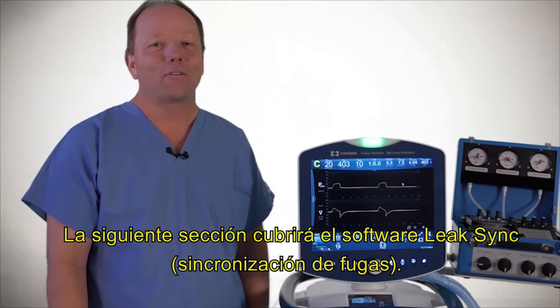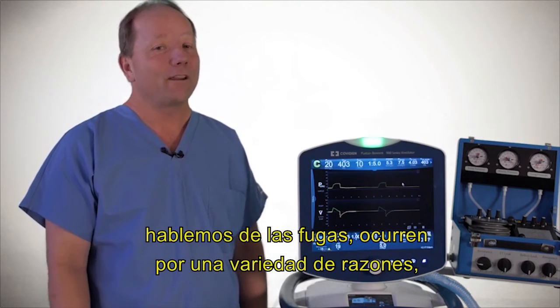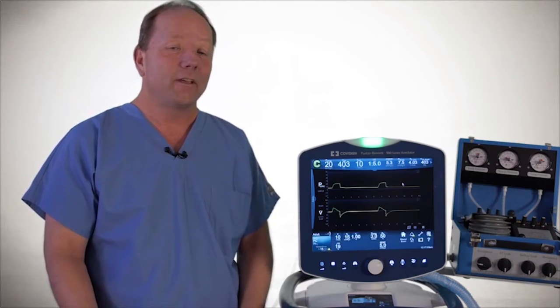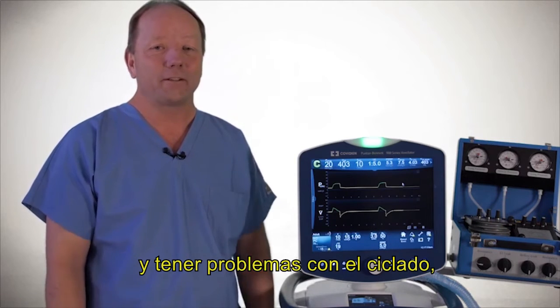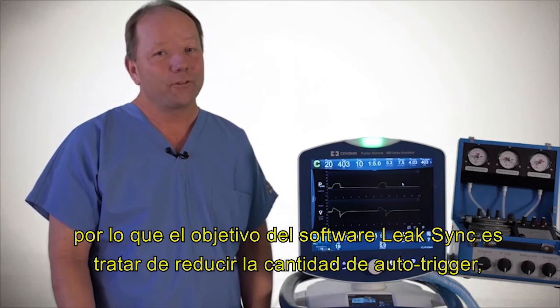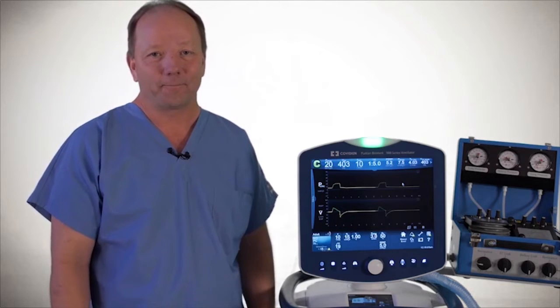This next section will cover the leak sync software. So let's talk about leaks. They happen for a variety of reasons, and they can be challenges in terms of setting sensitivities as well as having problems with cycling. So the goal of the leak sync software is to try to reduce the amount of auto-triggering and reduce the amount of delayed cycling.